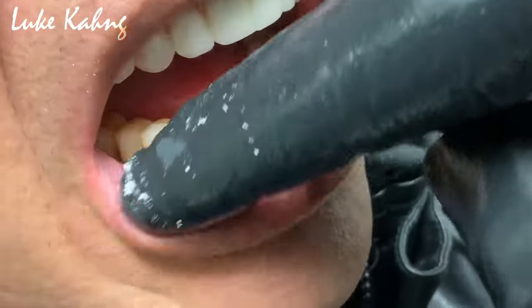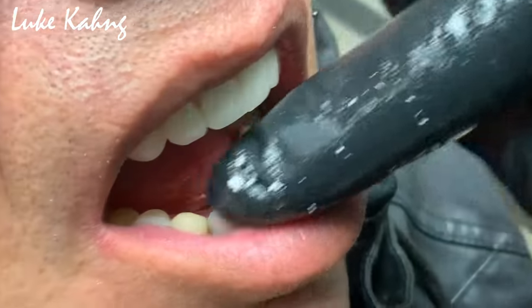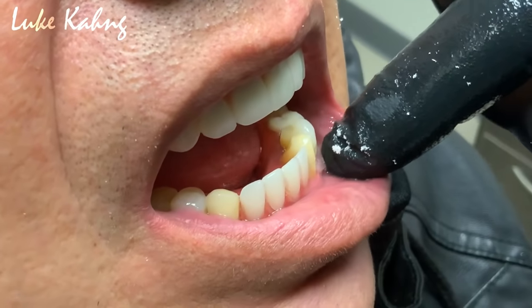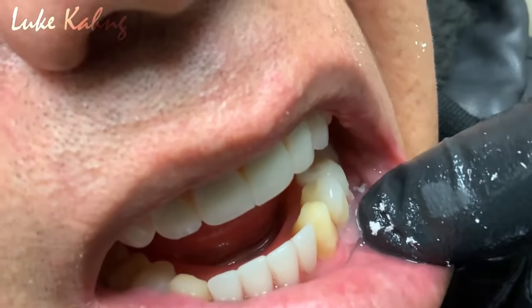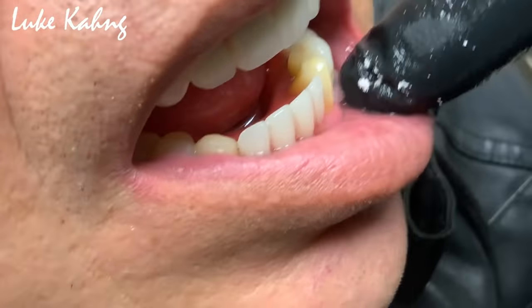I like to choose clear clasp whenever I'm in the aesthetic zone because you want it to look nice and aesthetic. Patient appreciates that too. They don't want a fake gum color looking here over a tooth that doesn't match, you know? So I usually try to do clear clasp in the front.